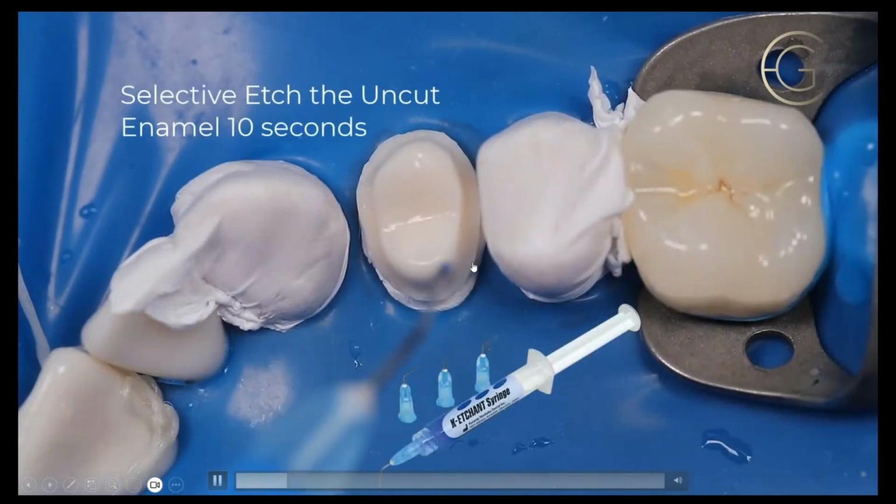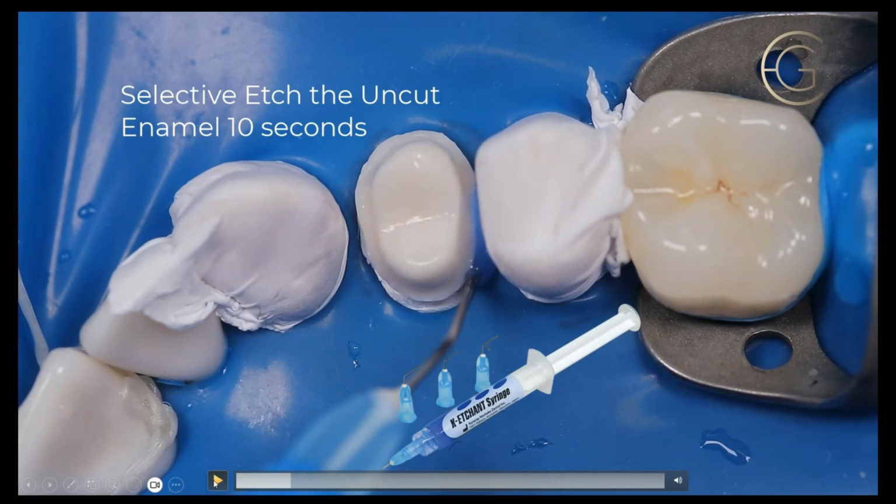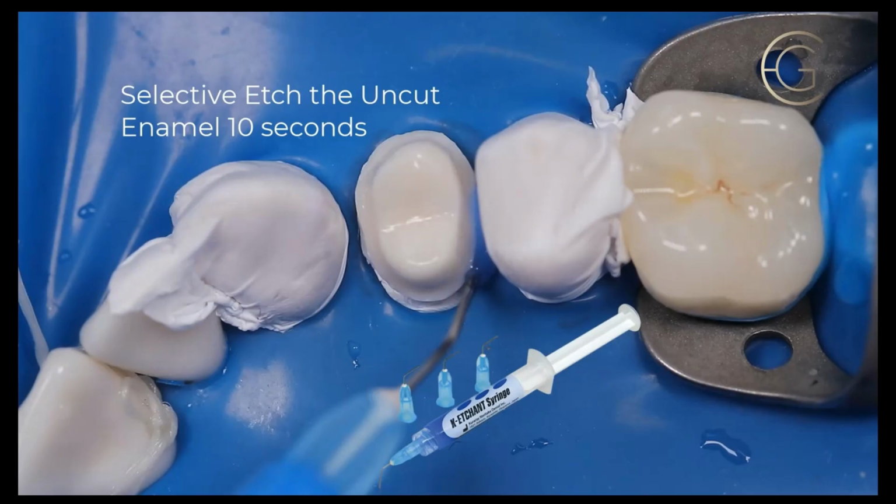So now I'm going to selective etch. Now, a lot of us misunderstand what selective etch means. Selective etch means you are etching adjacent to the cut enamel. You're not etching the cut enamel. That's a clarifier there.